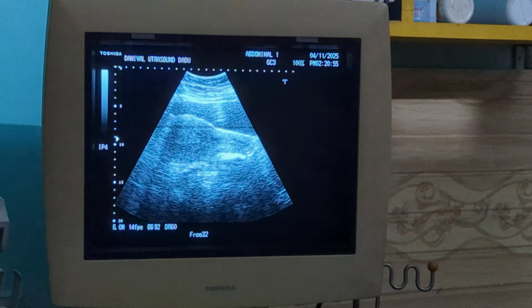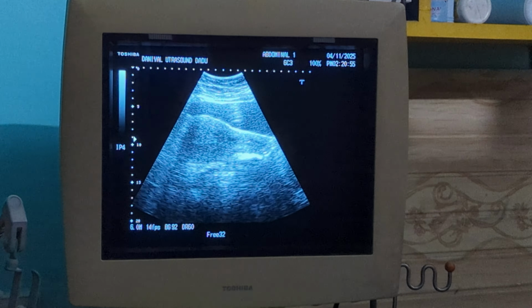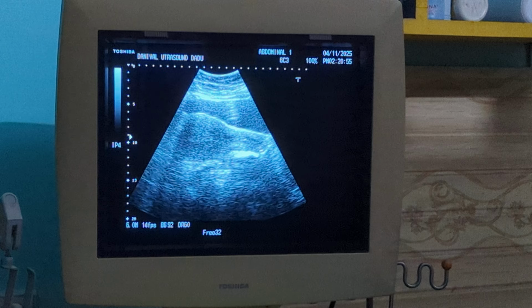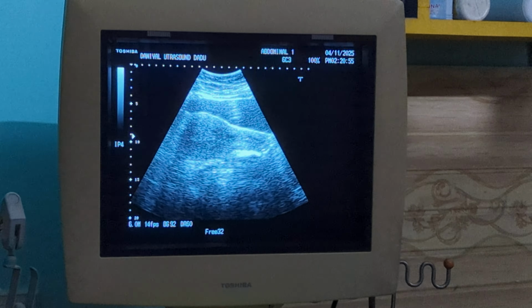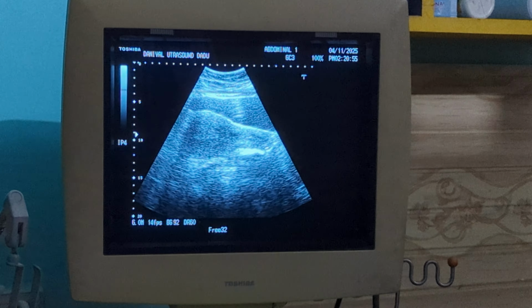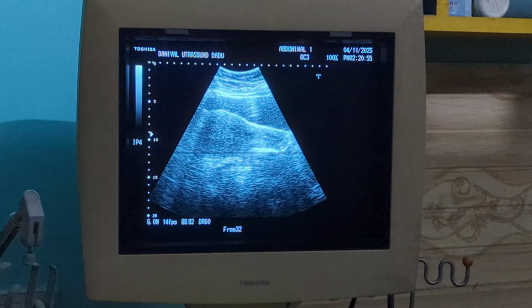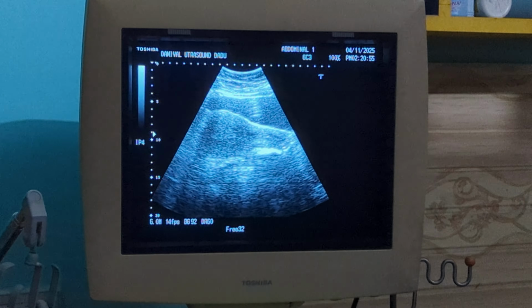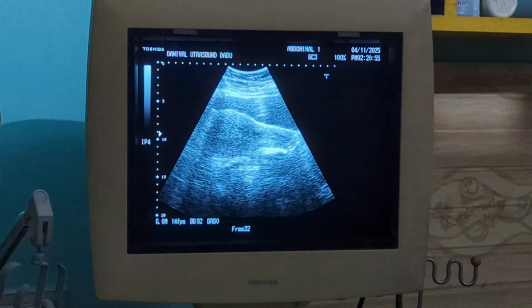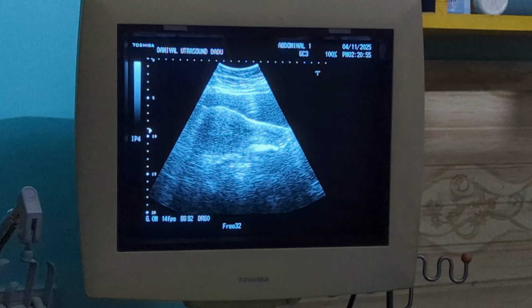In today's video, we will discuss a very common yet often misdiagnosed condition called adenomyosis of the uterus. The ultrasound shows here an enlarged uterus with features suggestive of adenomyosis, and the patient's history includes pelvic pain and heavy bleeding per vaginum. Now let's understand how to identify adenomyosis on ultrasound, how to differentiate it from fibroids, and what is its clinical significance.